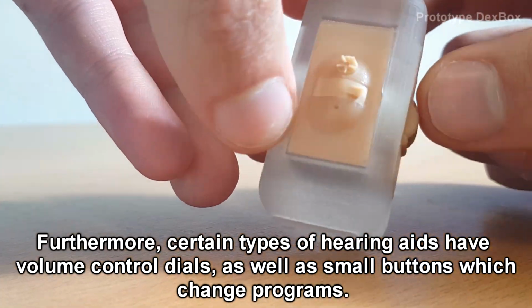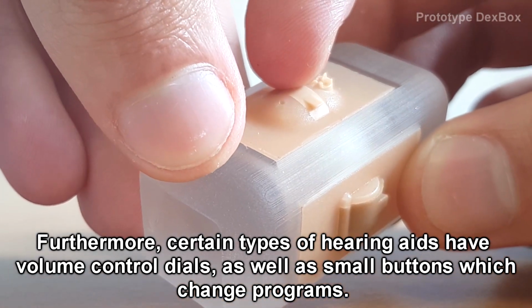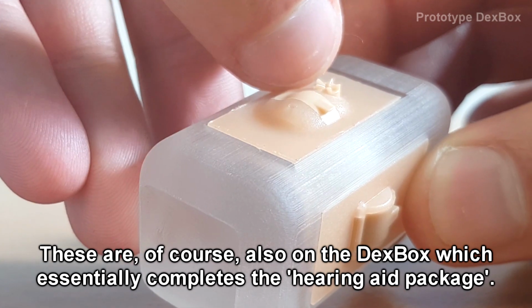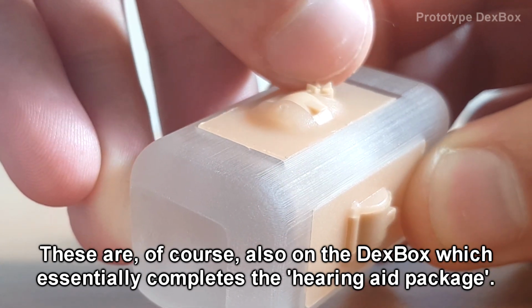Furthermore, certain types of hearing aids have volume control dials, as well as small buttons which change programs. These are of course also on the DexBox, which essentially completes the hearing aid package.